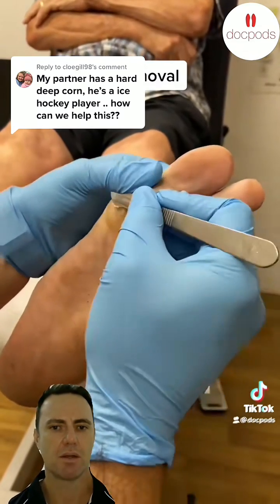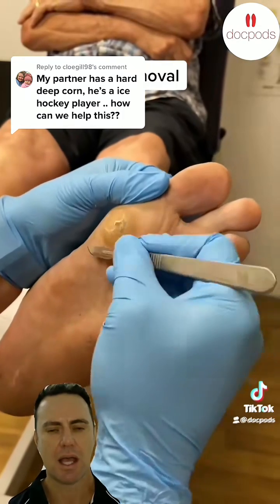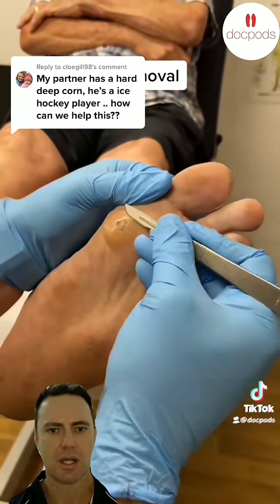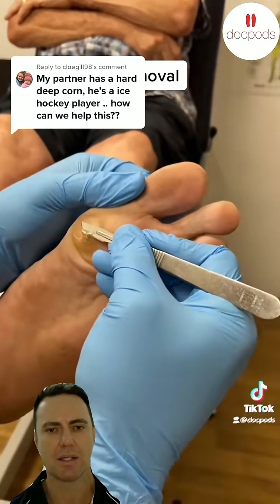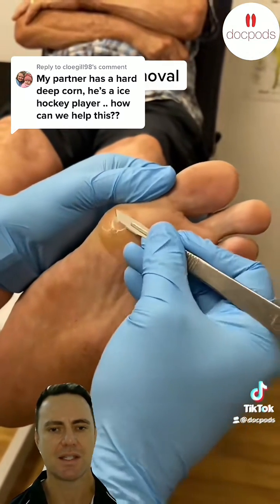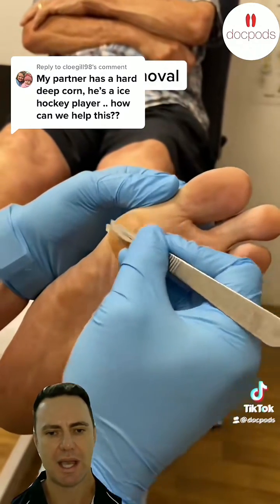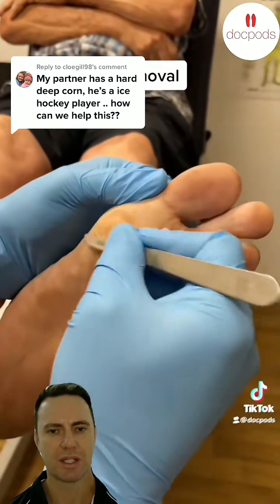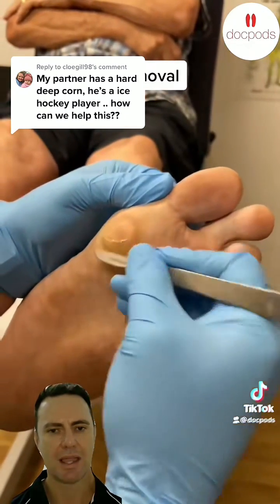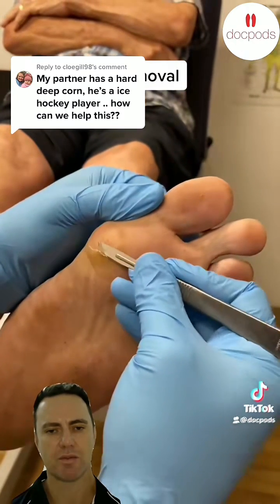So what we're removing here is a hard corn, and you can see that this calloused area has got a central hardened section that you can even see the scalpel sort of stops and has trouble cutting through it — that's how hard it is. A hard corn is a very dense section of hardened, thickened skin, and it usually has an overlying callous over the top of it. We remove all the overlying callous, which you can see we're doing now, and then we enucleate or cut out the really central cone-shaped section of the corn.